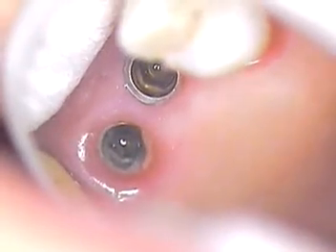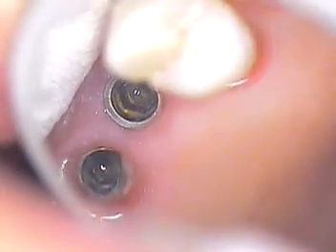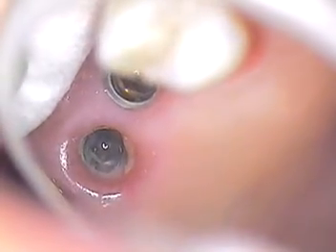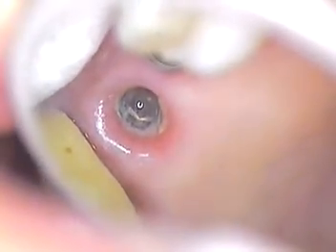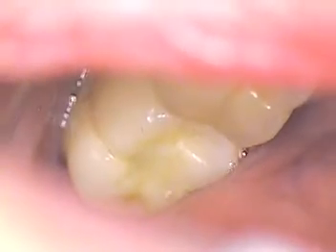Now that's in. I think if she just stays open like that, it'll be fine. Stay like that. Not yet — I want to let it soak. I want to just let it set. All right, we'll be right back in a few minutes.